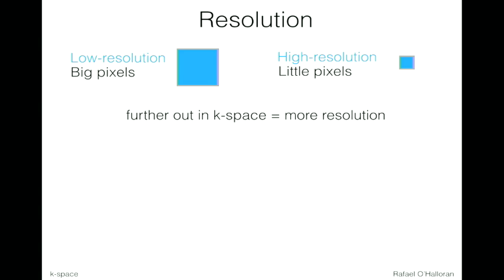And so in K-space, this means that I need to go further out, because as you saw before, the details are on the outside, and the further I go out in K-space, the finer these stripe patterns are. So you can imagine if I want to represent finer structure, finer details, I need finer stripe patterns, and that means going out further in K-space.